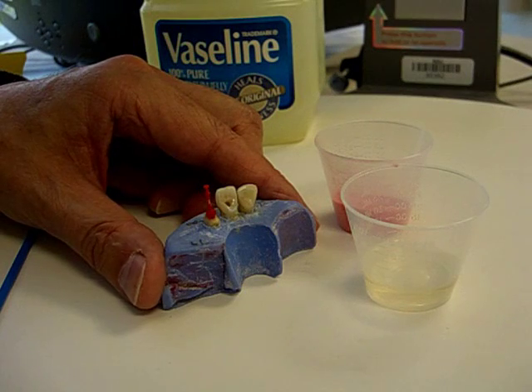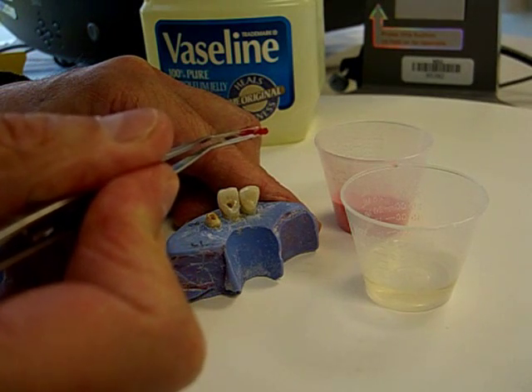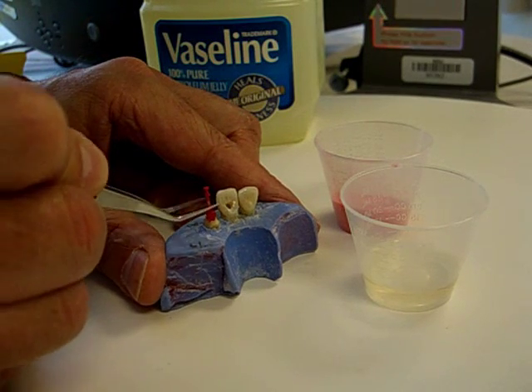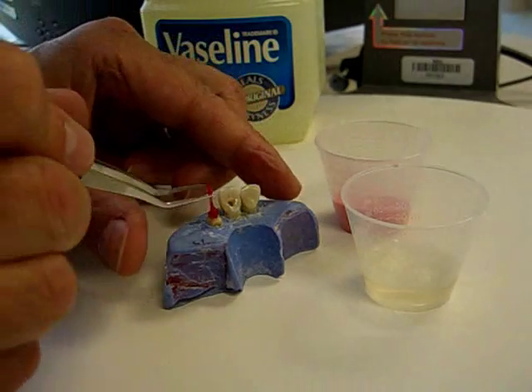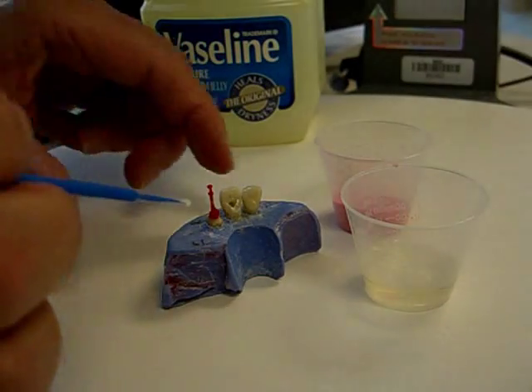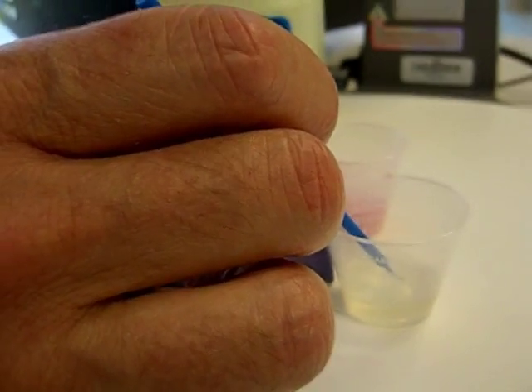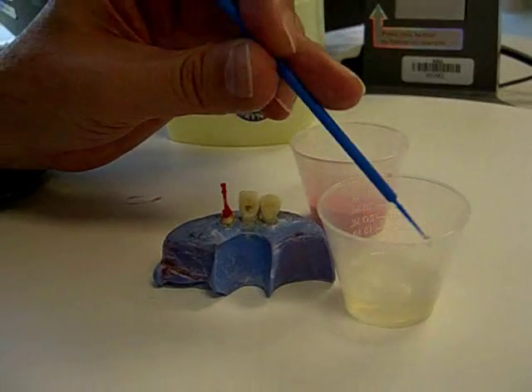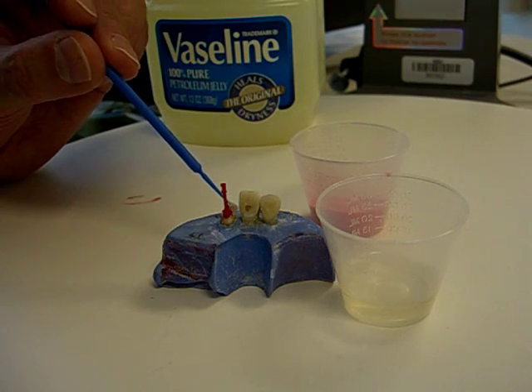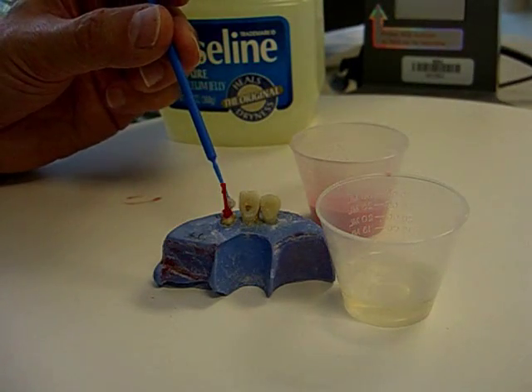At this point, the post portion of the post-core has been completed. I'll replace this in the canal and now begin to add in small increments the material needed to build up the core portion of the post-core. It might be a good idea to wet the coronal portion of this sprue pattern with some monomer to ensure that the monomer and polymer mix will adhere and bond much better.